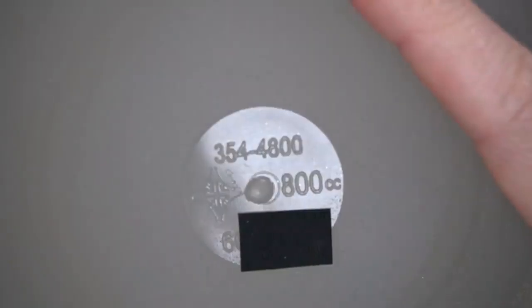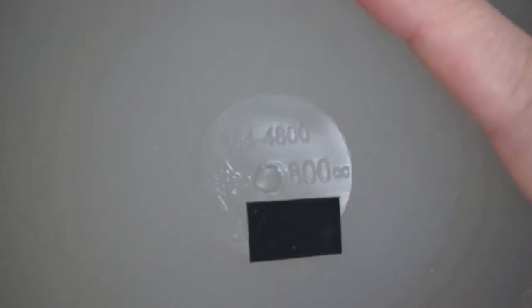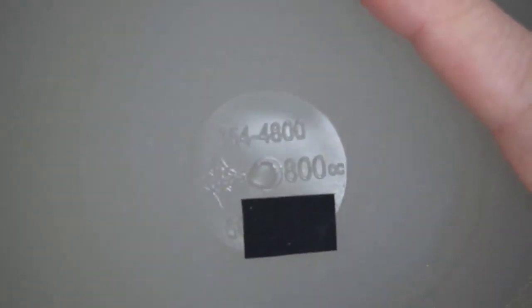Let's take a look. There are a few implants on the market with RFID tags — these aren't one of them. We can see the implant specifications molded into the shell. It's a type 354-4800. There's the Mentor logo, the size 800cc, and the serial number, which could potentially dox me so I'm going to cover part of that up.